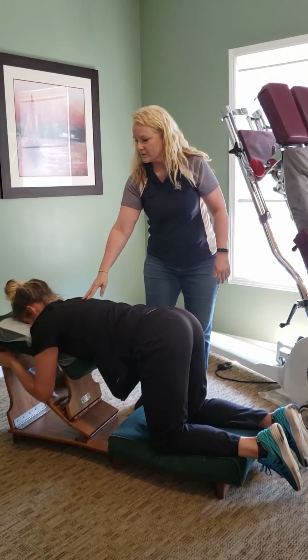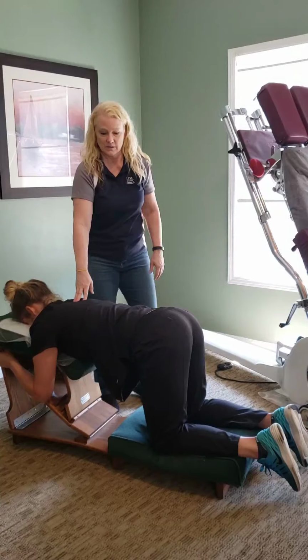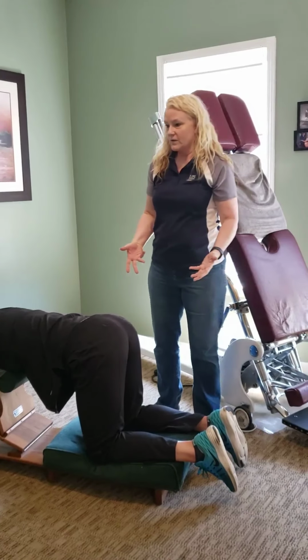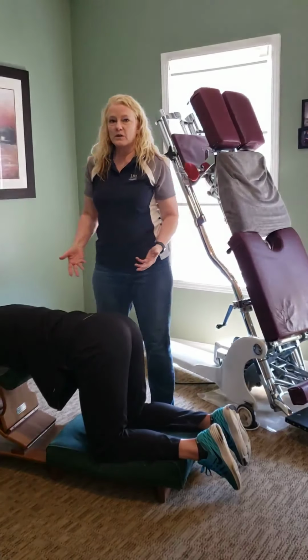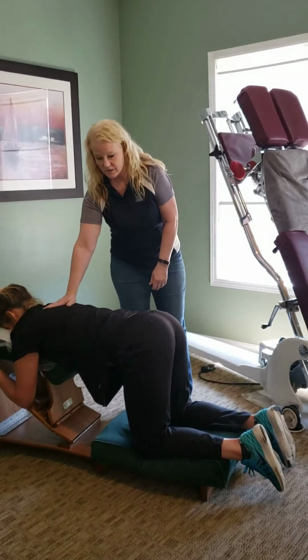The other thing is as soon as she got on the table, you want to make sure that you have your hand on your patient. You don't want to walk away, start talking and doing other things, and she has no idea where you're at. So you want to keep your hand on the patient and let them know where you're at all times.